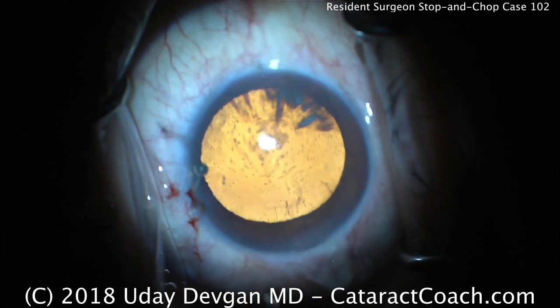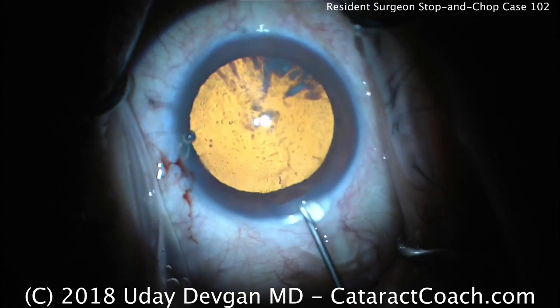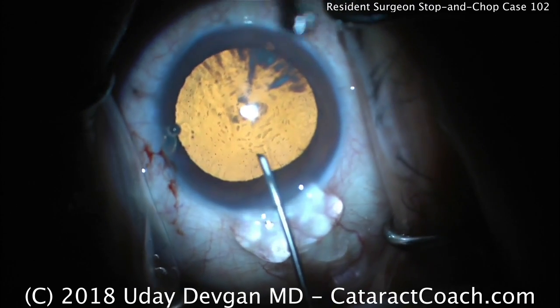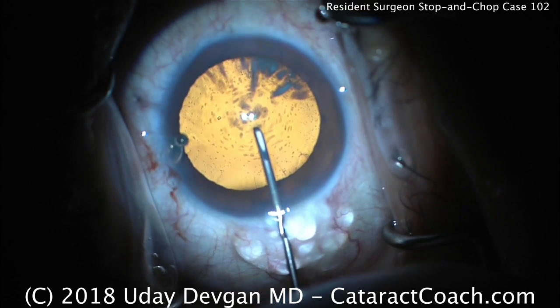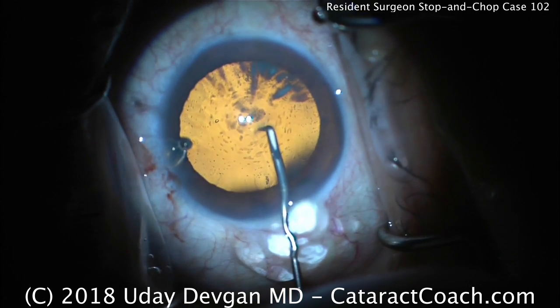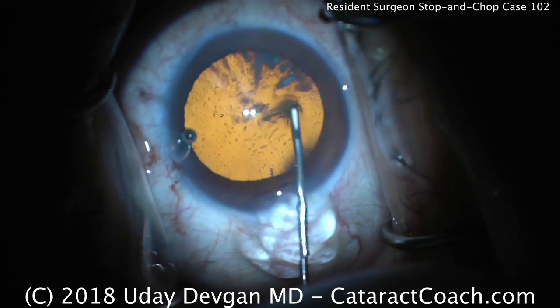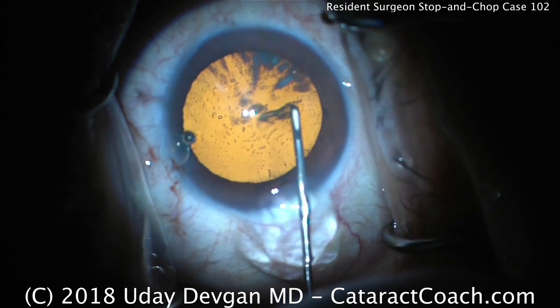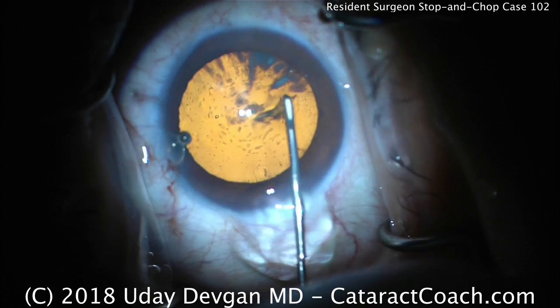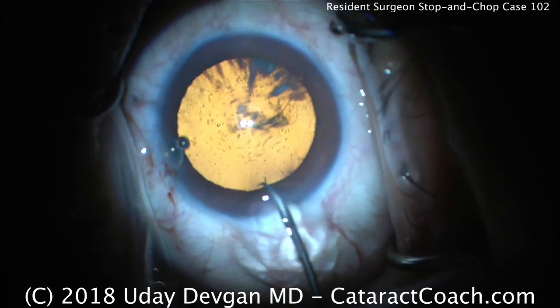The resident is choosing to use a cystitome to start the capsulorhexis. Look at the viscoelastic that exits the eye — that's common for the cohesive; it stays together as a big bunch. Cutting across with the cystitome and attempting to flip over the edge. There's an edge right there, and there's the flap that's turned over. Coming out of the incision.